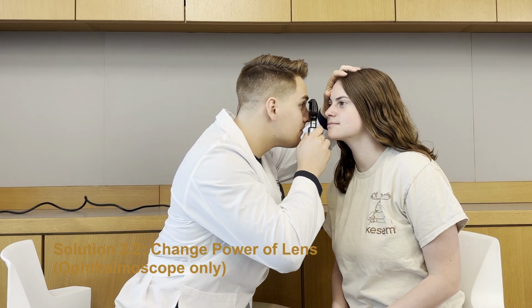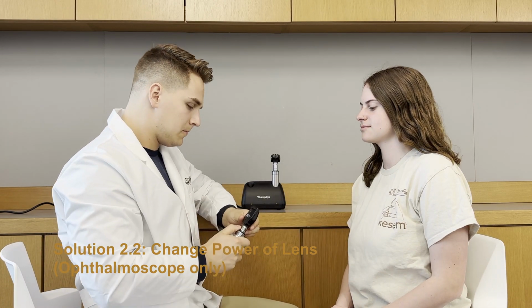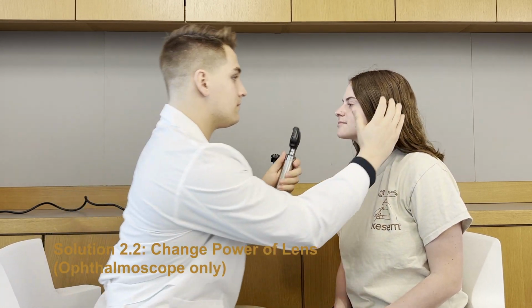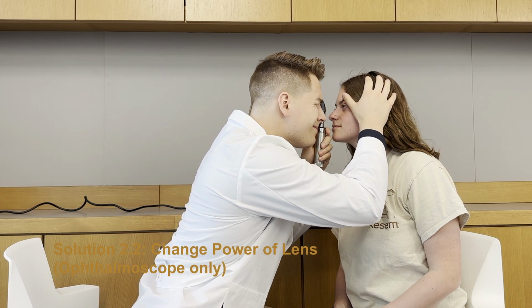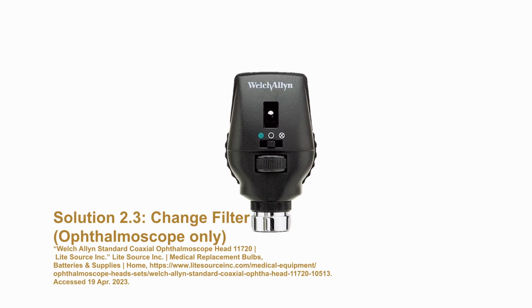To troubleshoot, set the diopter dial to an appropriate setting. Look through the ophthalmoscope 1 arm's length from another person's eye. Make small adjustments to the distance to see if the image becomes clear. Now that visual acuity is being accounted for.